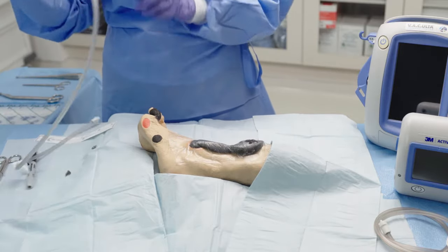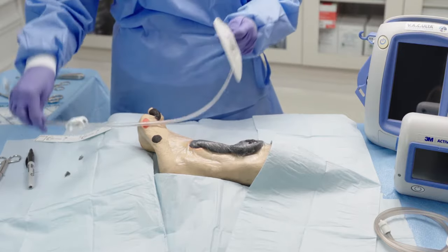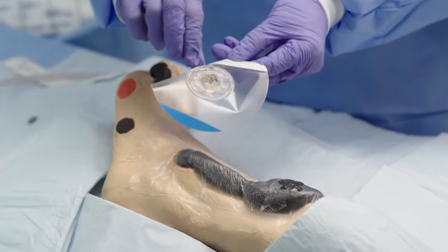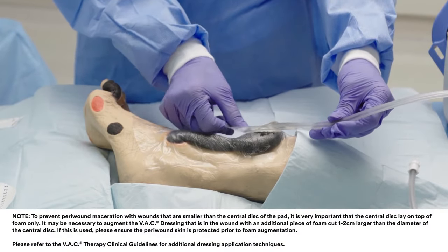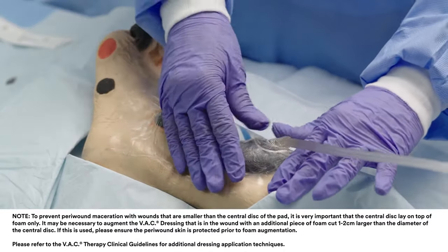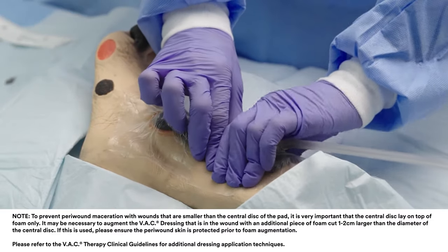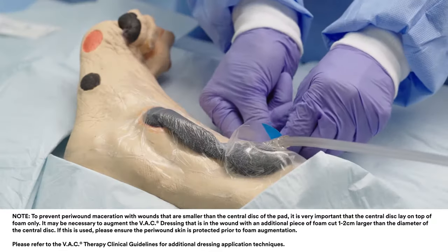Apply the pad, which has a central disc and a surrounding outer adhesive skirt. Remove both backing layers 1 and 2 to expose the adhesive. Place the pad opening in the central disc directly over the hole in the drape. Apply gentle pressure on the central disc and outer skirt to ensure complete adhesion of the pad. Pull back on the blue tab to remove the pad stabilization layer.